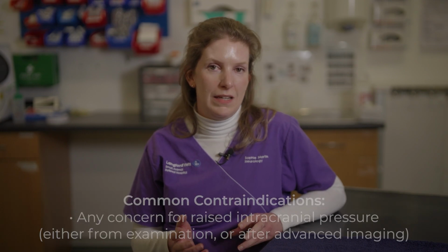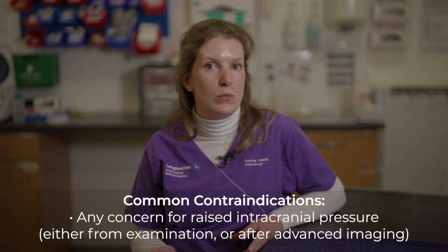It's important to think about when it's appropriate or inappropriate to take cerebrospinal fluid. So before we talk about the practicalities of how, we'd like to talk about the considerations of when you should or shouldn't take the sample. So the main contraindications of taking cerebrospinal fluid are particularly if there's any concern over raised intracranial pressure.